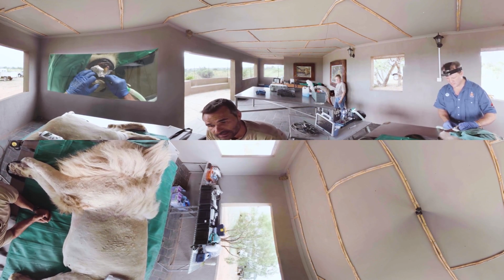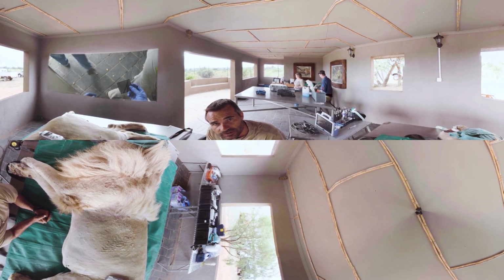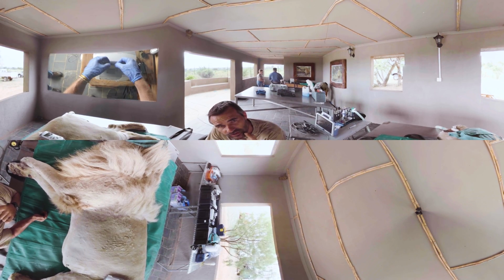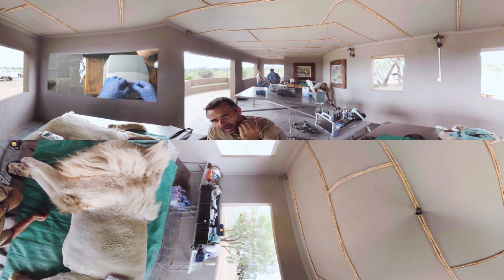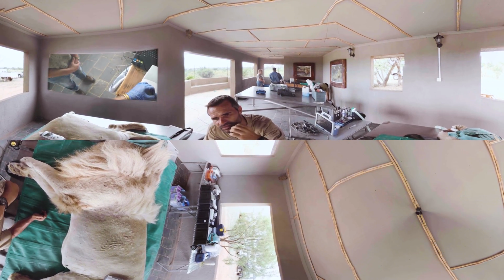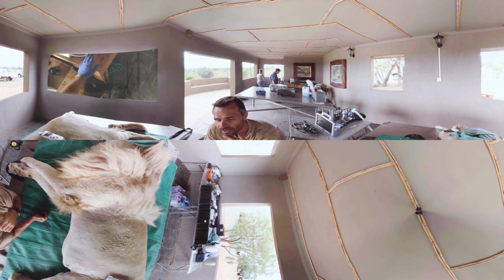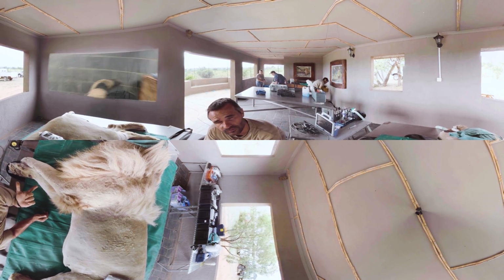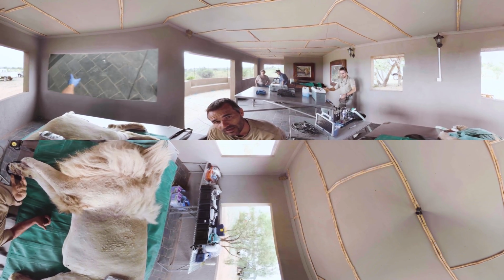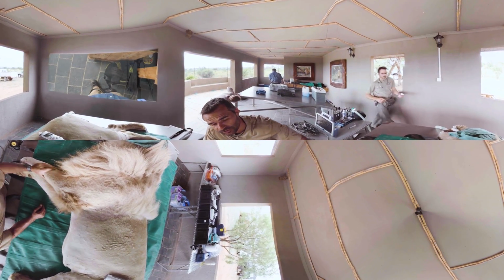Wow. So basically Aslan's teeth are all looking pretty good. Dr. Steenkamp's just taking some more x-rays of the other teeth. The one that impresses me the most is the total extraction of that one that was really bad, and how it's just remodeled itself. It's so rock hard. The gum has just come over and all the bone has filled that void up. So that's really impressive. What we have noticed, however, is that Aslan is pretty hard on his teeth, it seems, and he's got another incisor that looks like we might have to extract. Ah, boy. Just shows what they can do in a year.